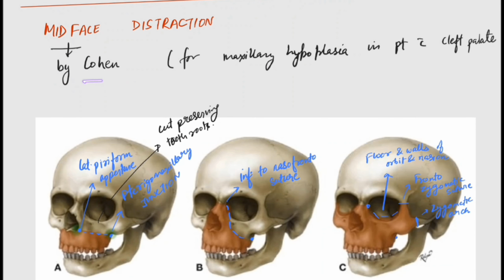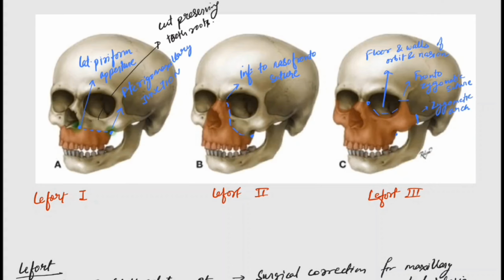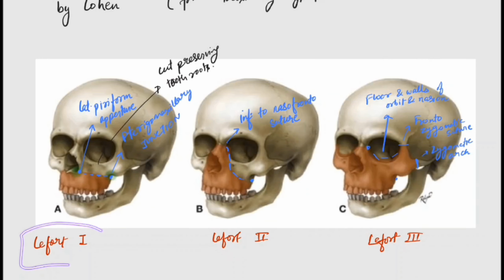Midfacial distraction was pioneered by Cohen. He used it for maxillary hypoplasia in patients with cleft palates. Now coming to the different types of maxillary distraction. The first is the Le Fort 1.